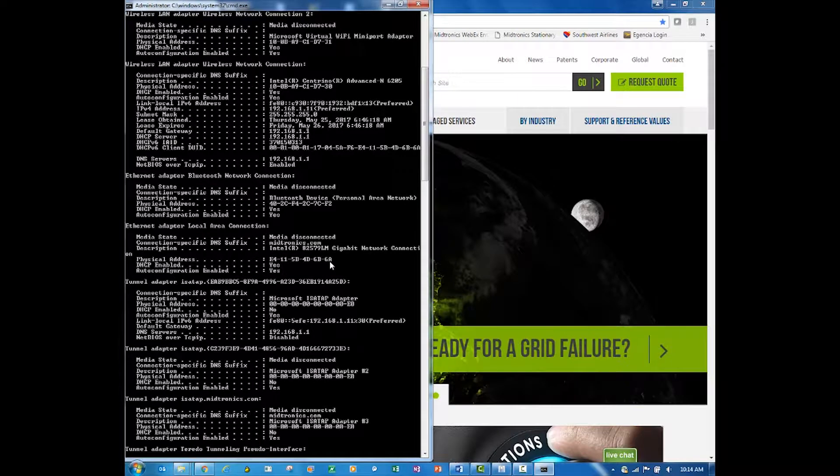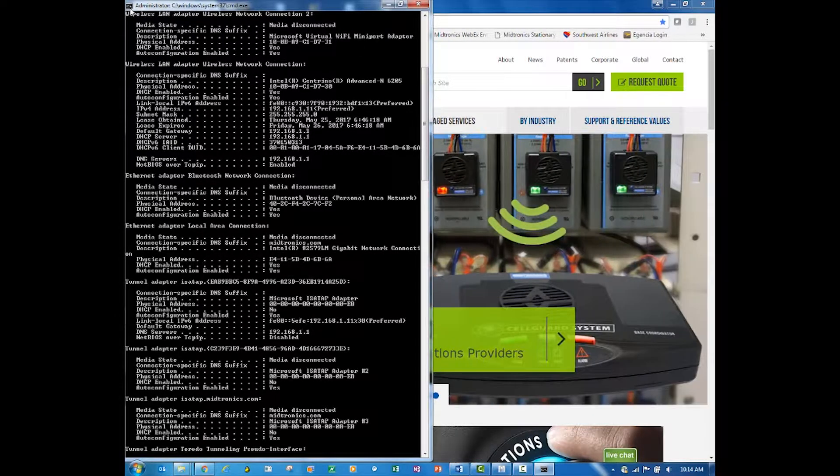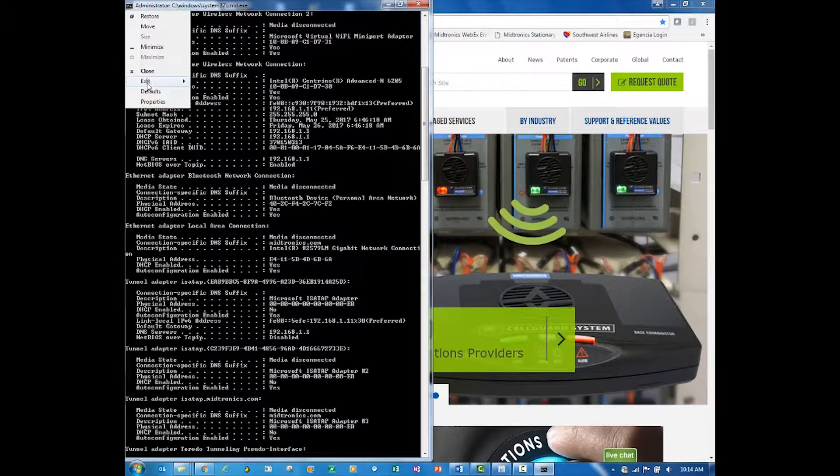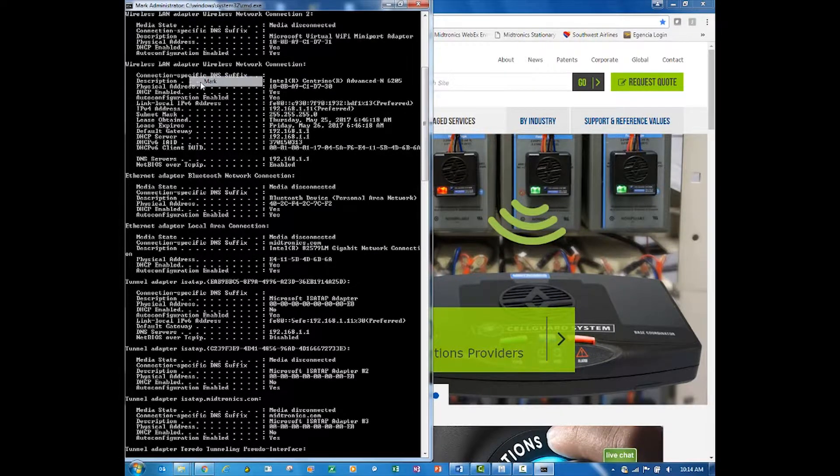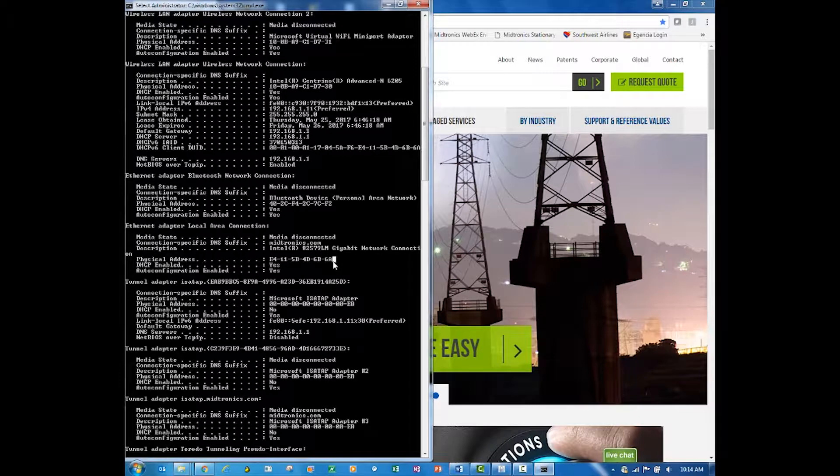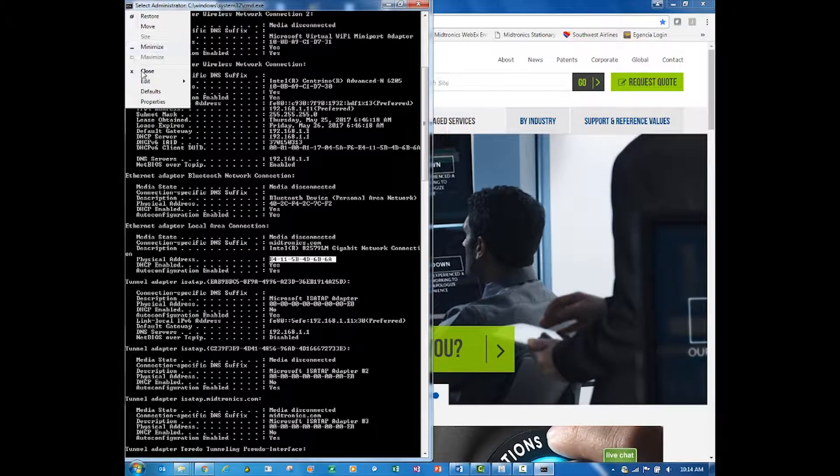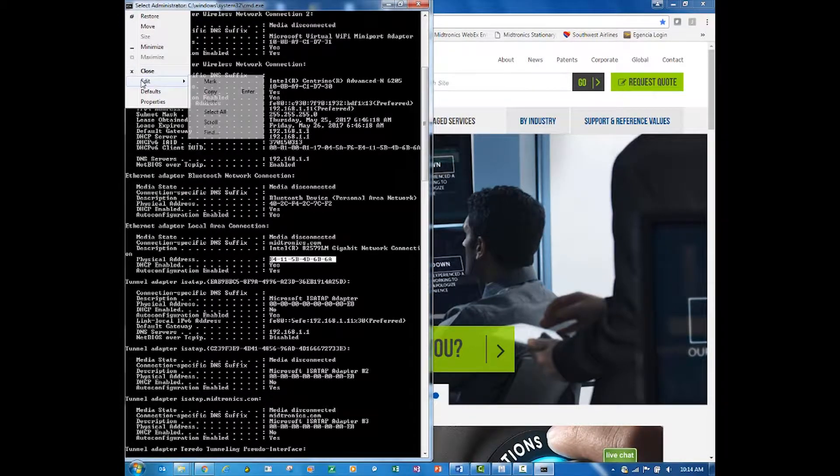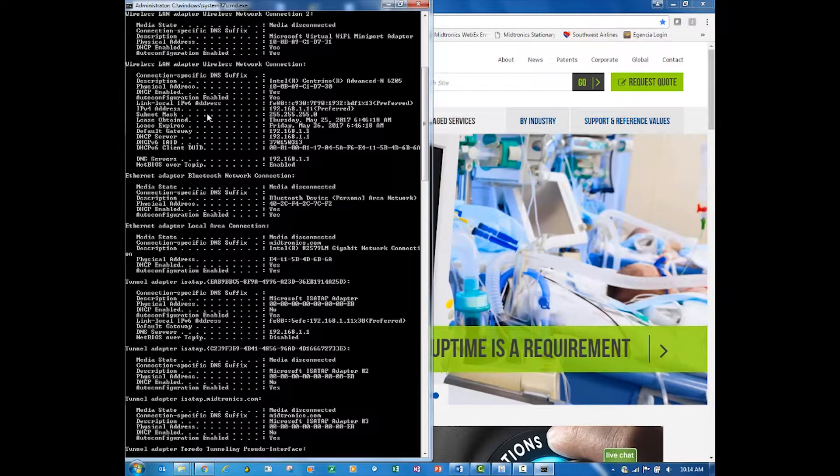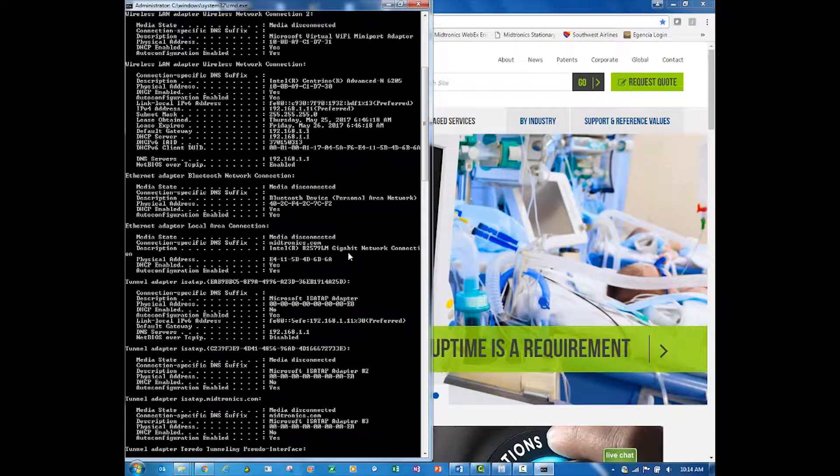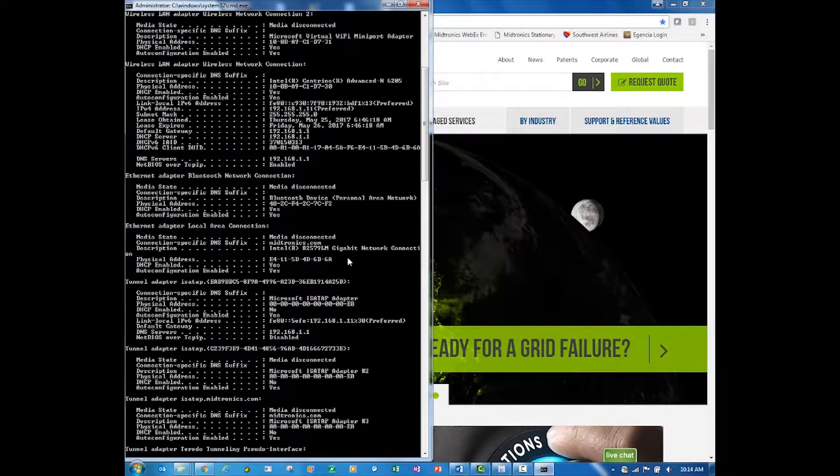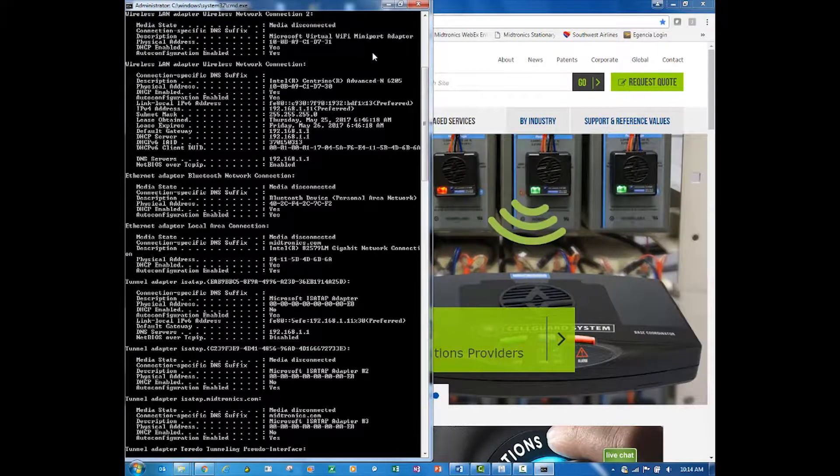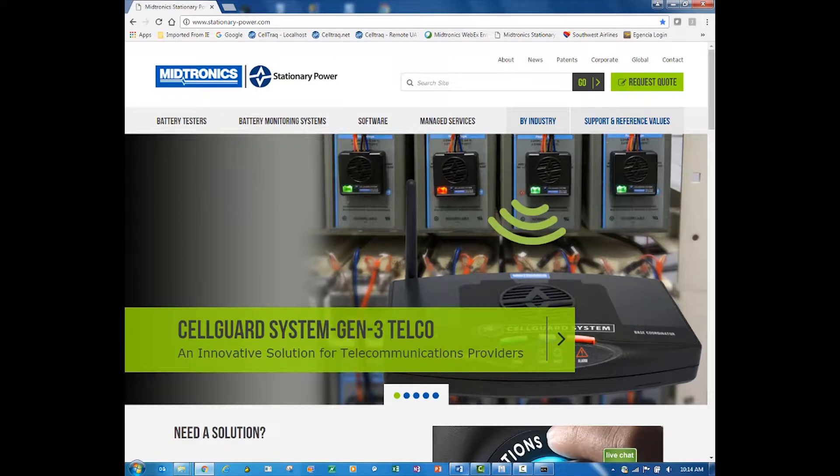So it is this physical address, and this would be the MAC address for this machine. If I wanted to copy that, the easy way to do it is go up in this corner, go to Edit, go to Mark. Mark will allow you to highlight that. Go back up into that corner, go to Edit again, choose Copy.